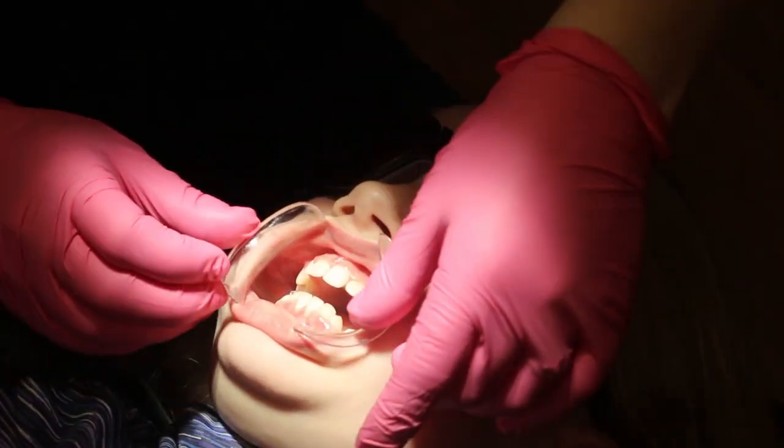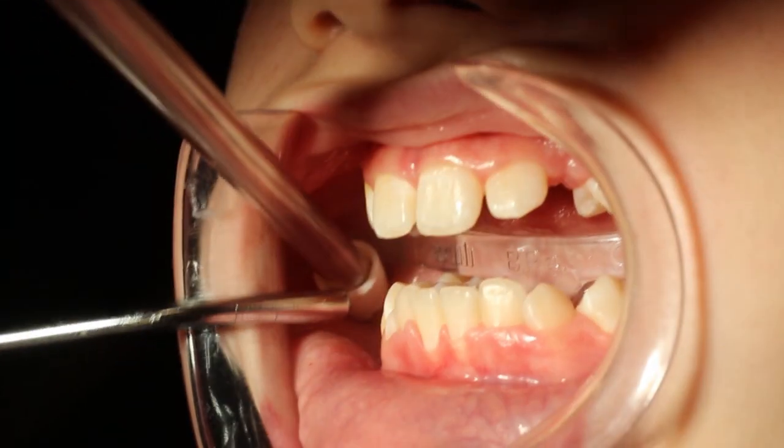We then need to retract the cheeks and the lips. You're going to be stretched out there for several minutes while we keep all your tissues away from your teeth. We condition the teeth and prepare them to accept the glue and the brace.